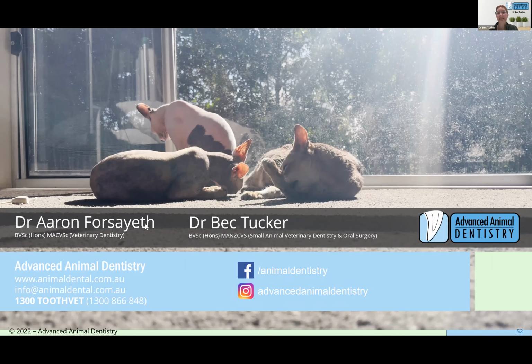So we commonly see dogs specifically with oronasal fistulas, nasal discharge from a maxillary canine tooth, and you'll take a dental x-ray and it'll look pretty normal in a lot of cases. Then you'll use your perio probe and you will basically pop it straight up into the nose. So again, that's partly why we say they're a diagnostic tool or an aid. They're certainly not something that will give you all the information that you need to make a treatment plan for a patient. But your point's correct. As with all radiographs, this is why orthogonal views are of such good value. You're looking at two dimensions, and so things obliterate each other and you just can't see things in certain views. And you need a fairly significant amount, I think it's 30% loss of density, to even see it, so it needs to be reasonably significant.